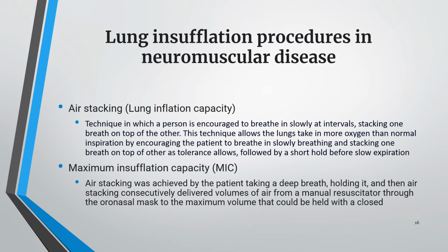In regard to maximum insufflation capacity, MIC, basically it's the same kind of process where you're going to stack breaths, where air stacking is achieved by telling the patient to take a deep breath, holding it, and then stacking breaths on top of that. The difference is that with maximum insufflation capacity, you're using a manual resuscitator to do this.